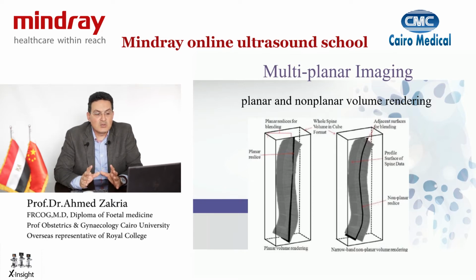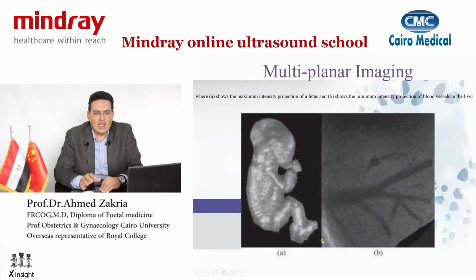When you're taking a multiplanar view, the structures are not always straight lines, they can be curved, and with 3D and image rendering, you can correct for that, and the machine can help you put all the slices together to get the real acquisition of what's happening in real time. The next step, once you have the information, is to work on two structures.